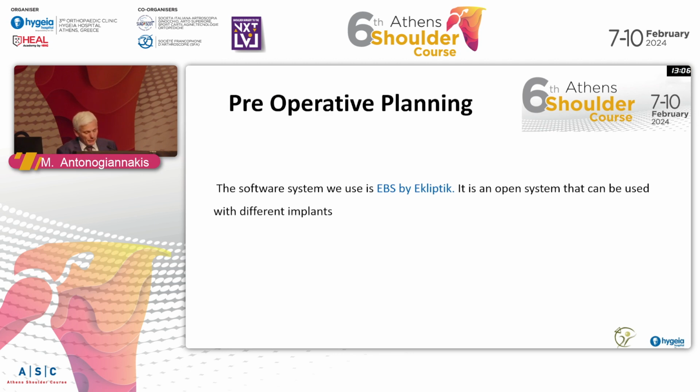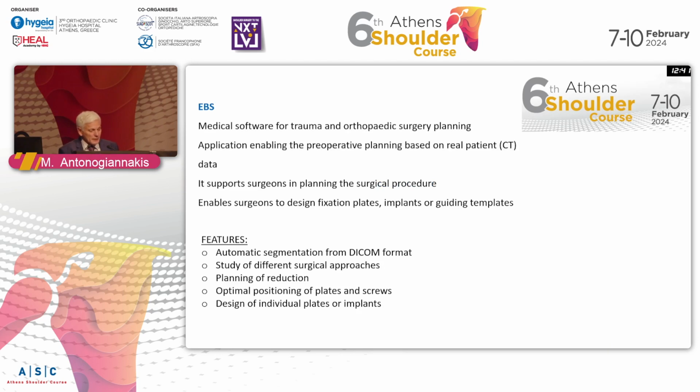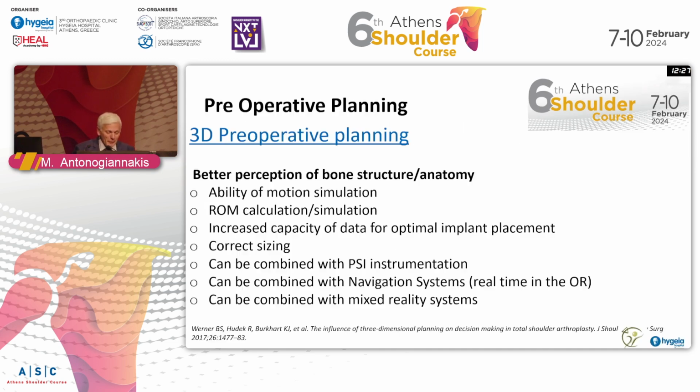Okay, we bought a software program, and in this software we could input any implants, and so now we were free. We could use any type of total arthroplasty, or we could also do planning for fractures and for all that we were facing in the operating theater. And this was something that made us say, oh, what a nice solution to the problems.